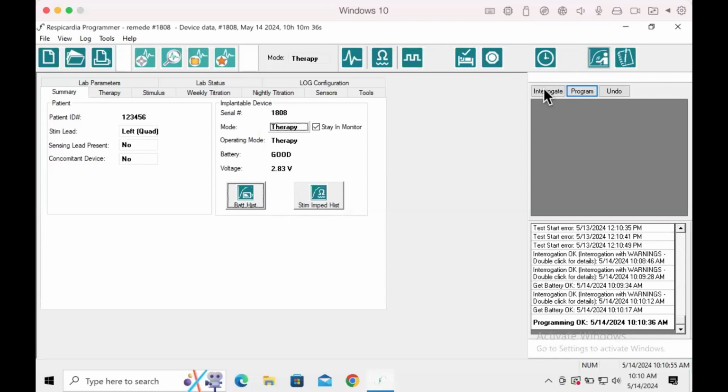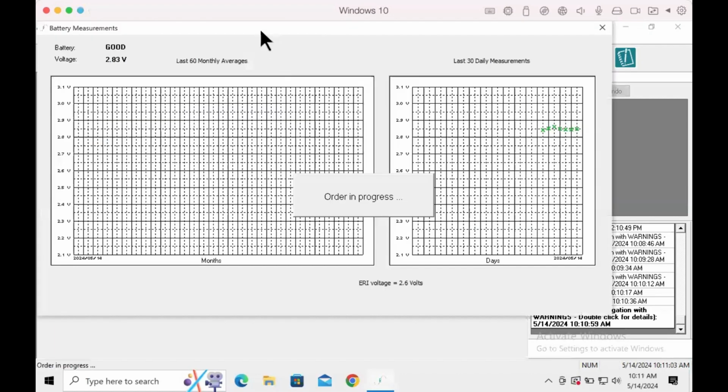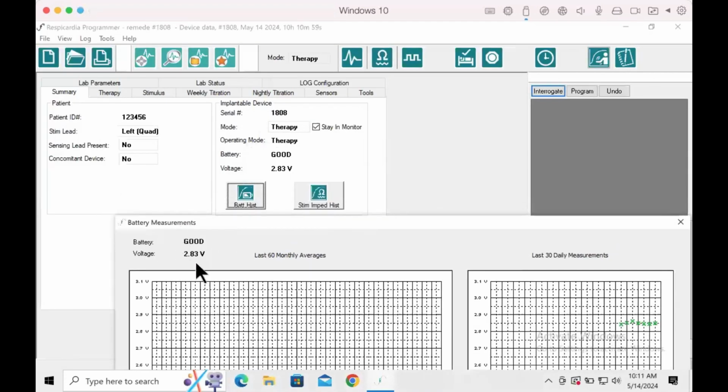Step 1. Interrogate the device. Step 2. Select battery history icon on the summary screen. You will notice battery status and battery voltage on the top left-hand side. It is also visible on the summary screen above the battery history icon.